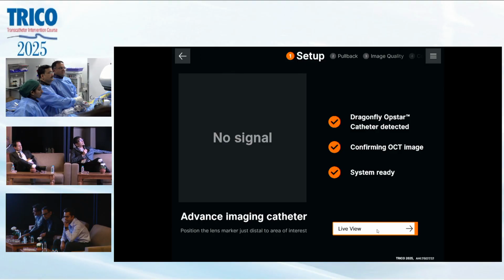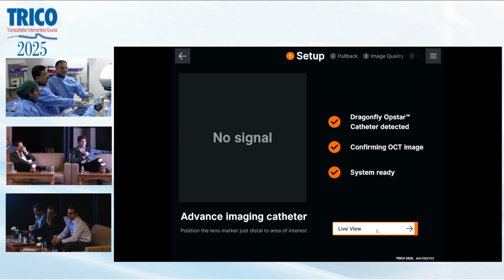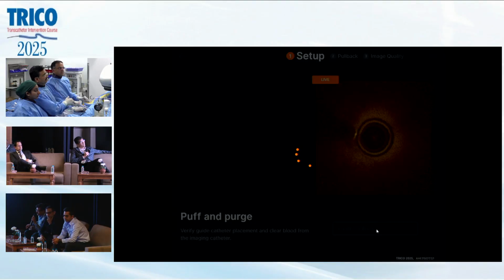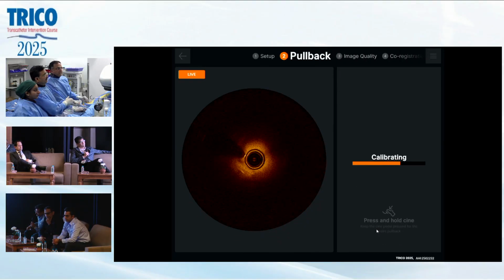Is drug-eluting balloon available in India? You guys have experience with that? Extensive experience. So then you would prepare this lesion much better, right? You will do cutting balloon and scoring balloon before. Let's bring the OCT screen on. Then with DCB, it is better to go ahead with 1:1, preparing the lesion by cutting.